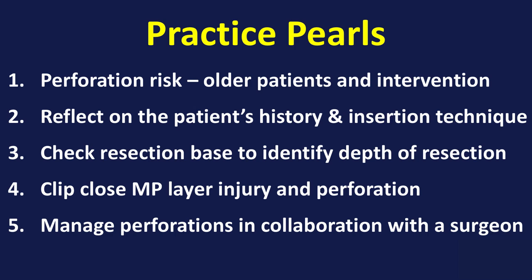Once you do a resection, make sure you examine the base to identify the depth of the resection. If it is deep, involving muscle injury, close the defect with clips. And whenever you have a perforation, even if you've managed it, make sure you get your surgical colleague on board. Thank you.